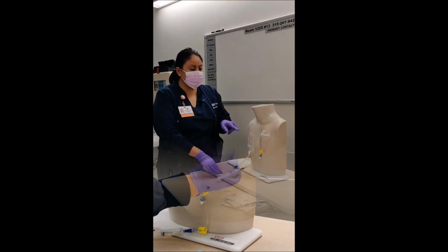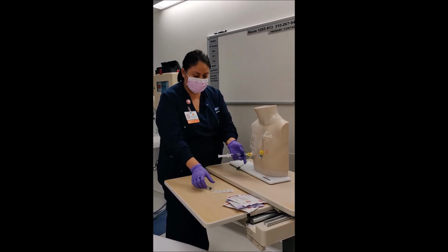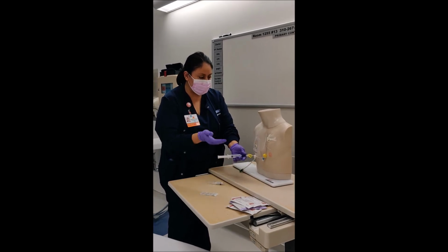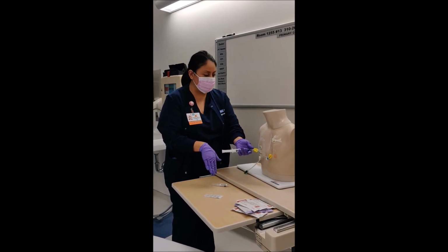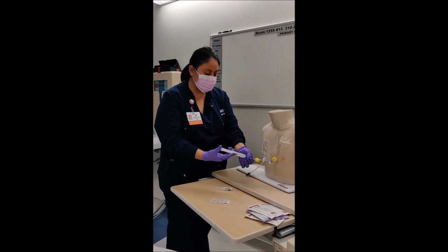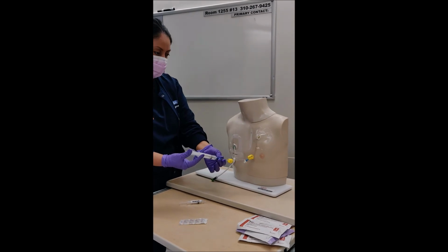So now it's time to deaccess the portacath. I have my flush, I have my heparin, and then I have my Band-Aid. In this case it is a power port, so we're going to instill 500 units of heparin per the doctor's orders. So we're going to flush, and I'm doing the pulsating method.